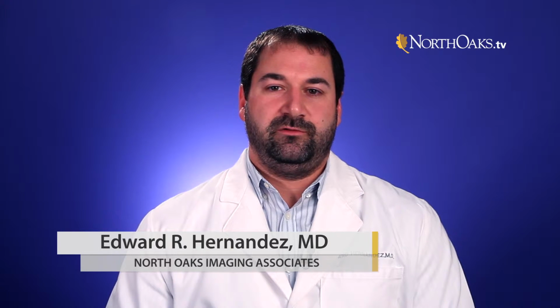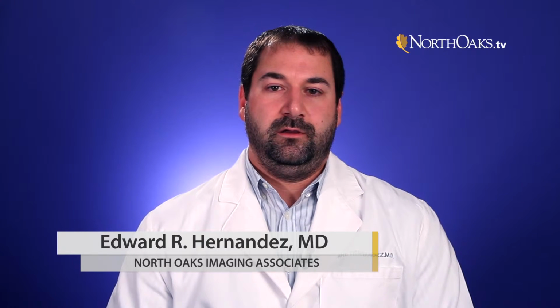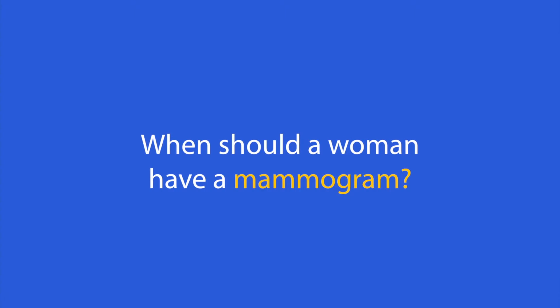Diagnostic mammograms are performed on patients that have symptoms, including pain or a lump, as well as on patients that have an abnormality on the screening exam. A mammogram is truly the key to early detection of breast cancer.